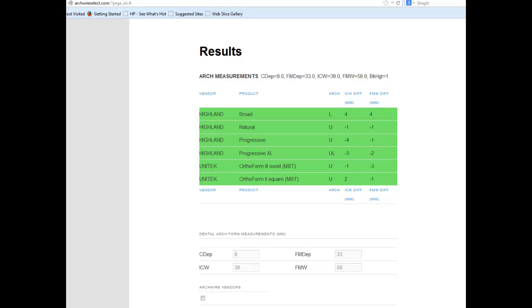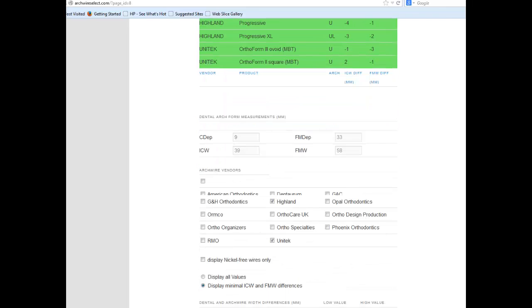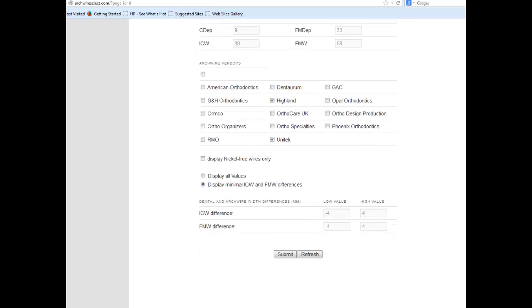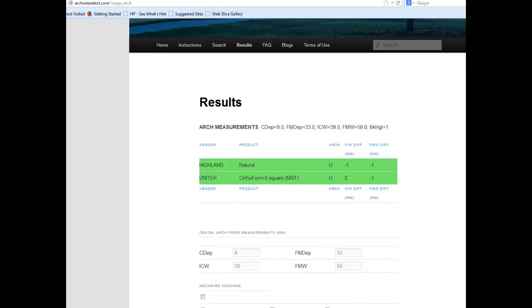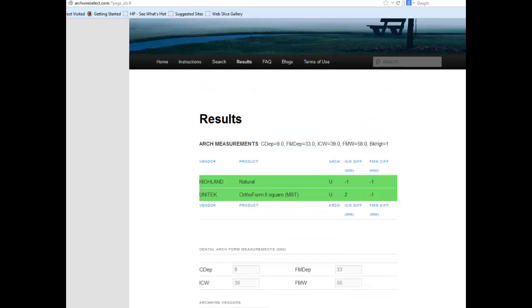Notice that the purple and red rows are no longer displayed. Six different arch wires from Highland and Unitec meet our search criteria. Assuming we wish to keep the canine and first molar widths unchanged as much as possible, and because these are nickel titanium wires requiring little if any customization, we will accept only width differences of at most 2 millimeters — or 1 millimeter per side — for both the canine and first molar. Entering these new search values, we now have only two arch wires to select from: a Unitec Orthoform 2 and a Highland Natural, both upper arch wires.